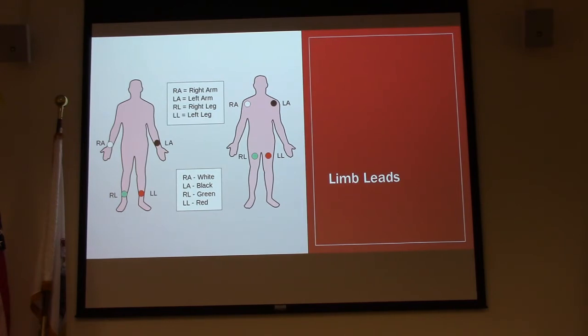It works a little bit better, but you will pick up more STEMIs. Try it yourself. Next time you have someone who has a STEMI and you have a little bit of time going to the hospital, put them back on the thoracic area. See what you're missing, because you will see a change in your rhythm interpretation for these if you don't do it the correct way.